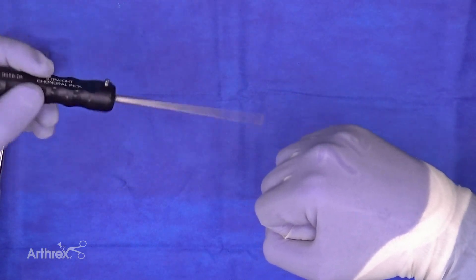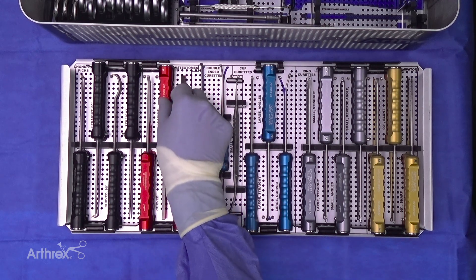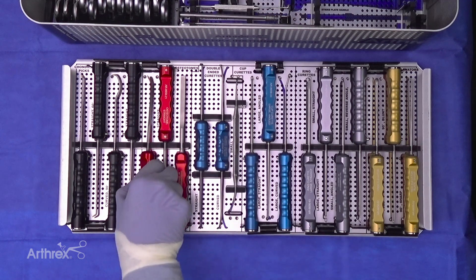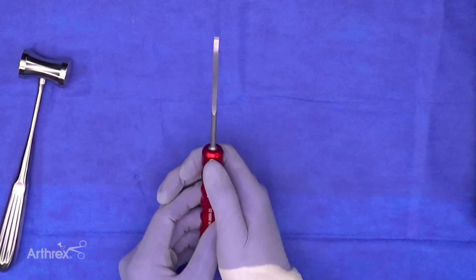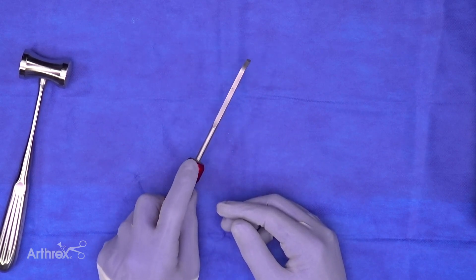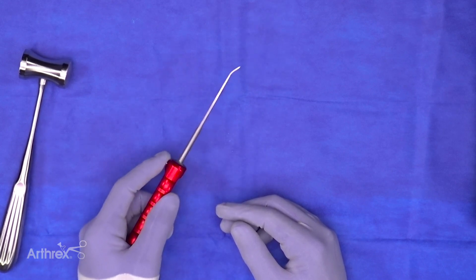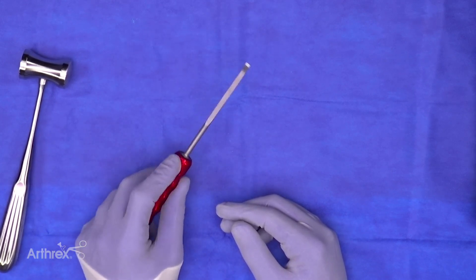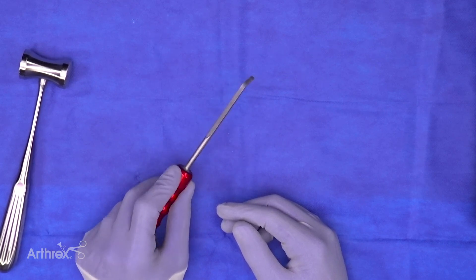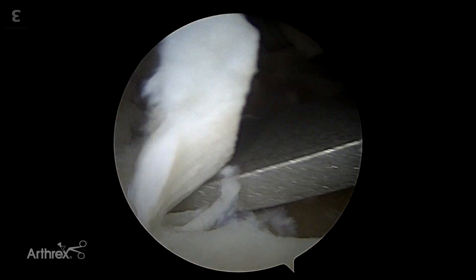Shifting gears to osteotomes: we have three specialized instruments — a curved osteotome, a straight narrow osteotome, and a wider straight osteotome. One thing you'll notice is that all of these instruments have a little nub feature, giving the surgeon tactile feedback for the working end. When the nub is at 12 o'clock under the index finger, that's the way the instrument is designed to function.